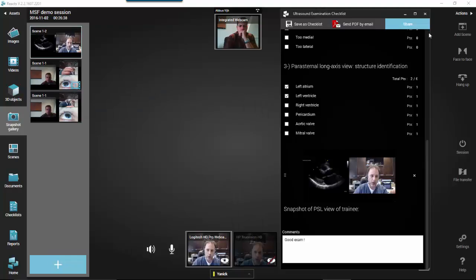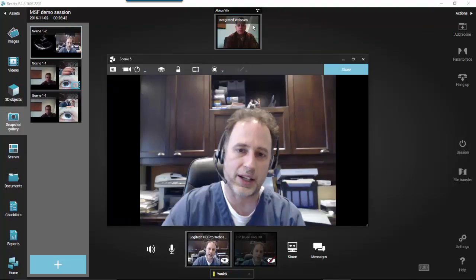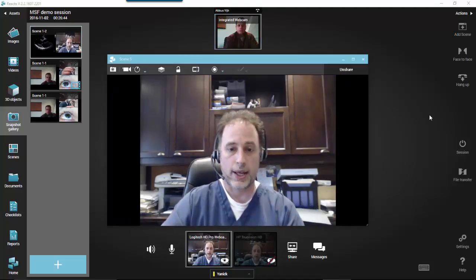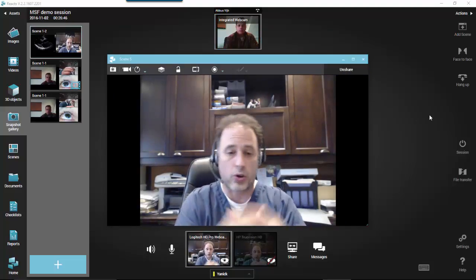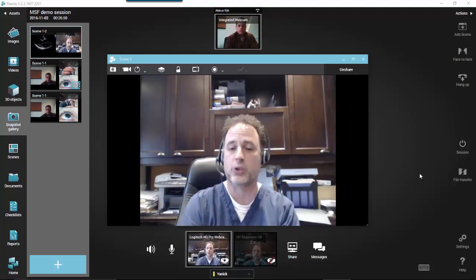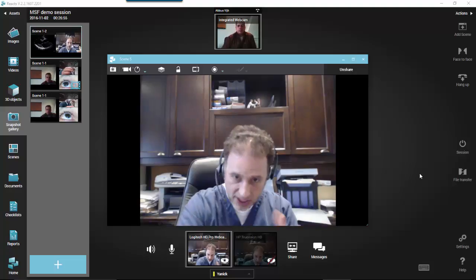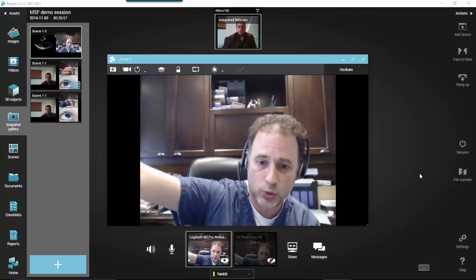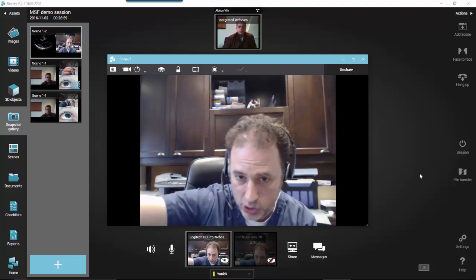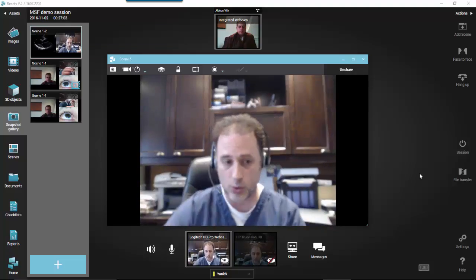So this shows you how you can be using a checklist or report template in order to complete your assessment. So either you do it when you're offline and then you're sending everything asynchronously to the user that will check it out, to your consultant, and he can reply to you, or you do it live as we've done.